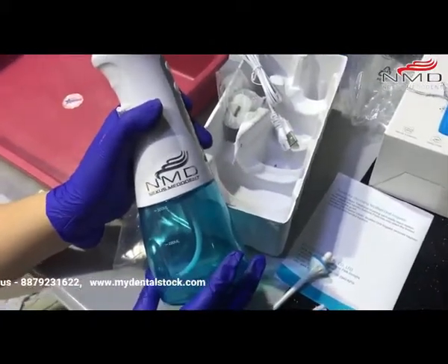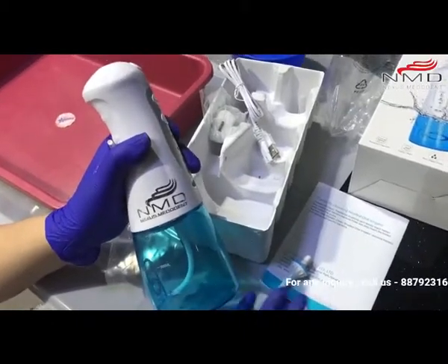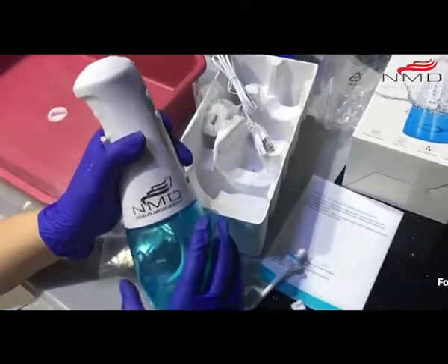The charging time is basically 4 hours, and the working time is up to 10 days. You can maybe use it for a month also. So it's very good.